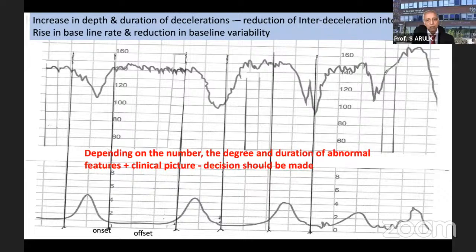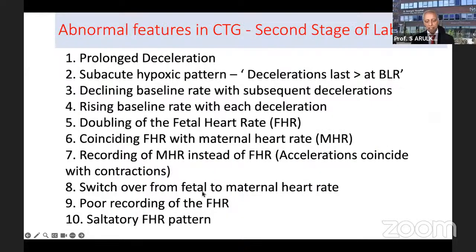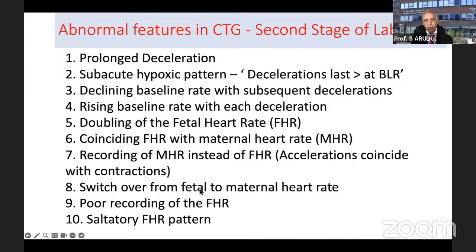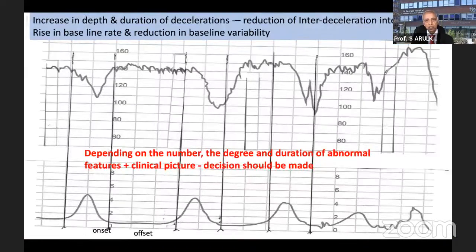If the heart is unable to cope and there is less oxygen to the heart, the deceleration will take some time to recover. So as time goes on, if you draw the same two lines, the decelerations are coming a little bit later. As you could see, it picks up a little bit later and it becomes more late to pick up. And as a result, the decelerations get more prolonged and deeper, and the inter-deceleration interval gets shorter and shorter.